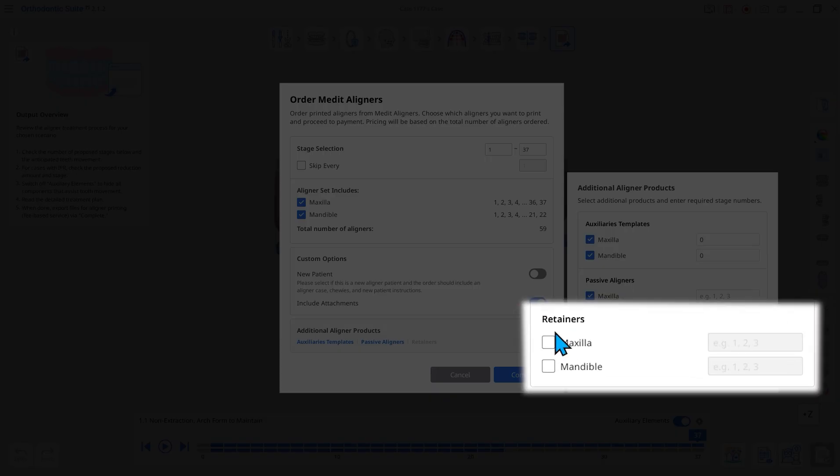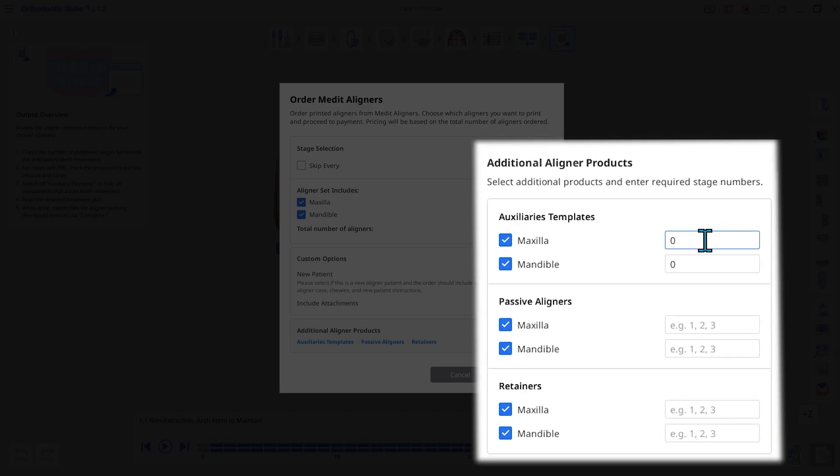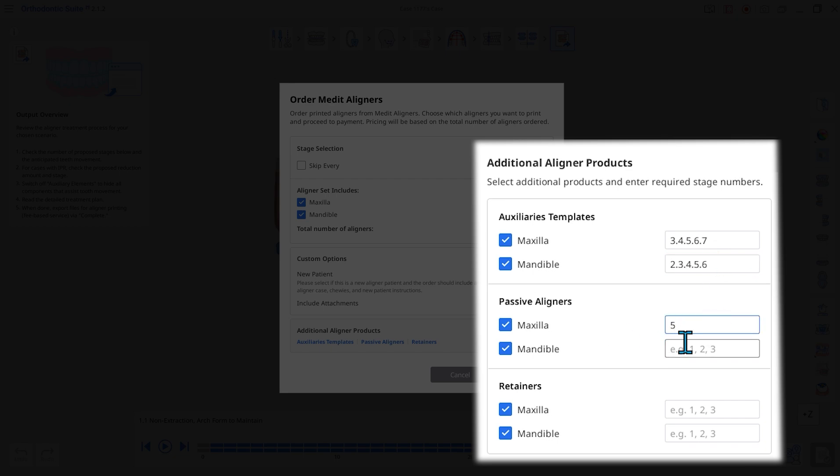Retainers are used to hold teeth in position after treatment is complete. You can order each product by filling in the required stage numbers for the upper and lower arches in the blanks on the right.